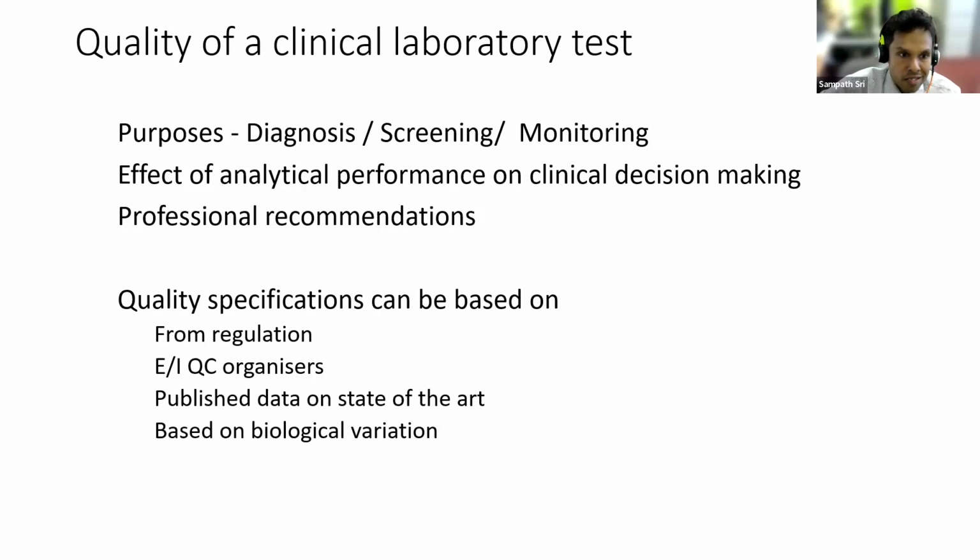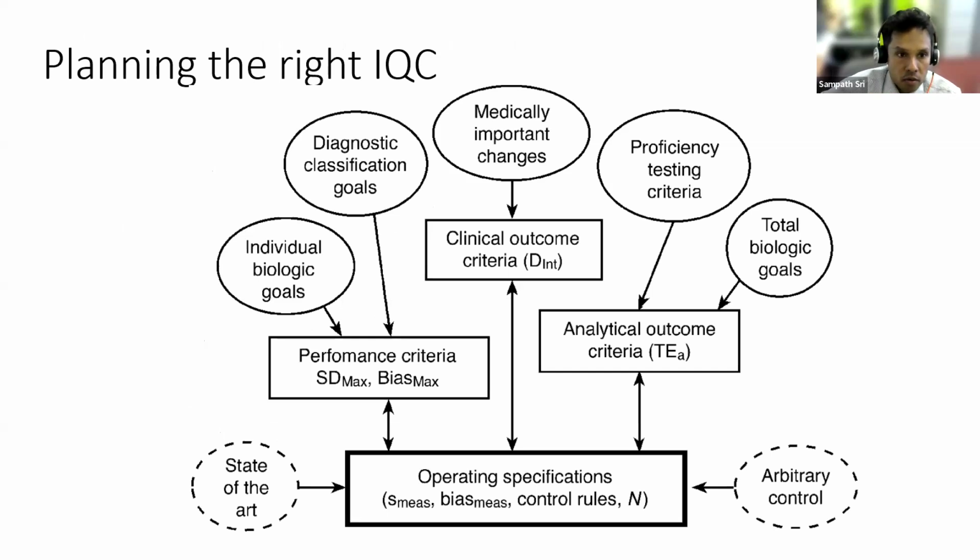These quality specifications may come from regulators or from external or IQC organizers, or come from published data, or they can be based on biological variations. When we are planning a QC, we have to consider all these factors.